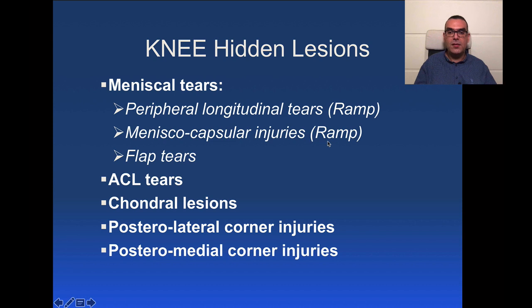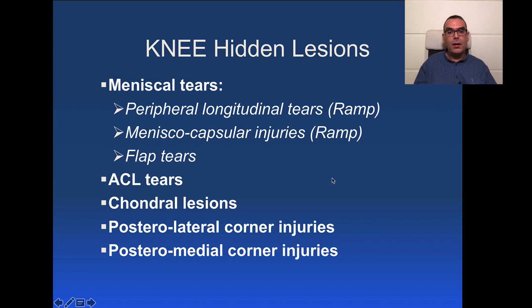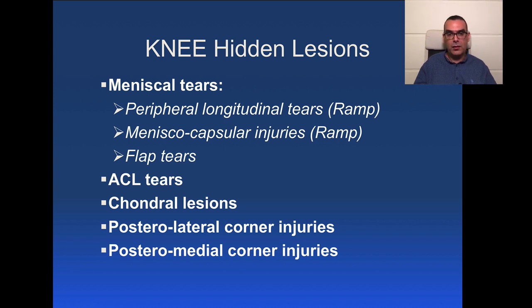Ramp lesions are very commonly associated with ACL tears. When you see an anterior cruciate ligament tear, one of the things you must search for is a ramp lesion. ACL tears can be quite difficult to assess on MRI, and especially partial or small tears may be missed if not probed correctly. You have to be very meticulous when commenting on the ACL.